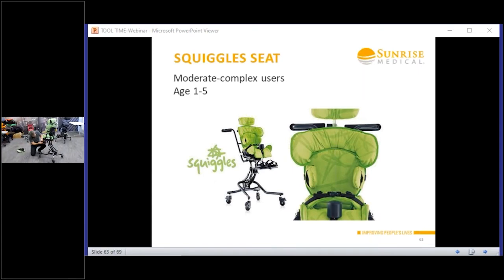Should have seat depth as well. And there's seat depth here as well. Just under, Rob's just loosened an Allen key, okay, and then that seat just pulls out. So that just looked a bit trickier because all the Velcro of the seating held it in place. So it's just giving that massive amount of growth. You could then stick it right down, maybe.